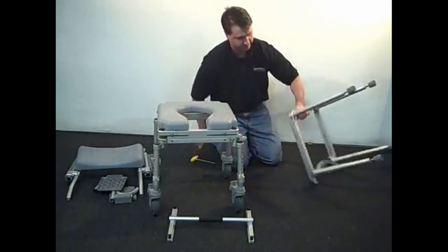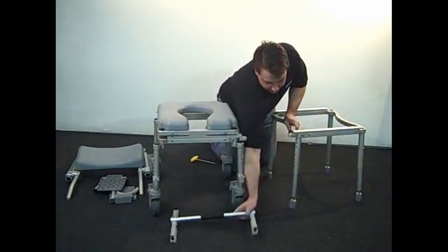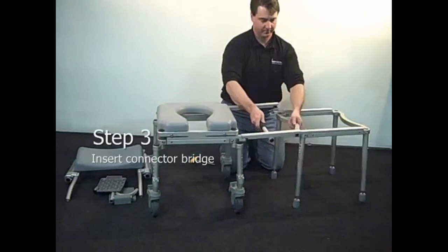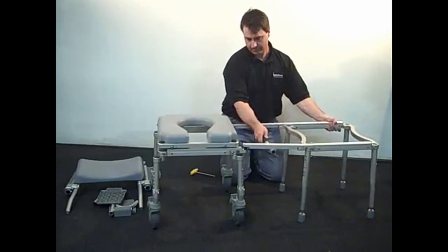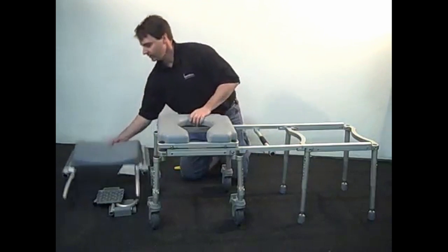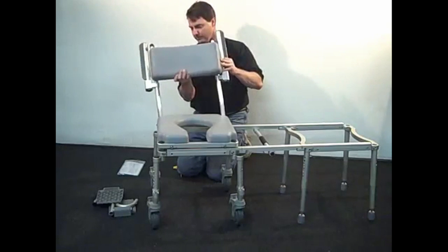Now, flip the tub section right side up next to the rolling section. Place a connector ridge between the two sections. You may need to adjust the leg heights for both sections and want to make sure both frames are as level as possible. The factory setting is for a right-to-left slide from the rolling section to the tub section.